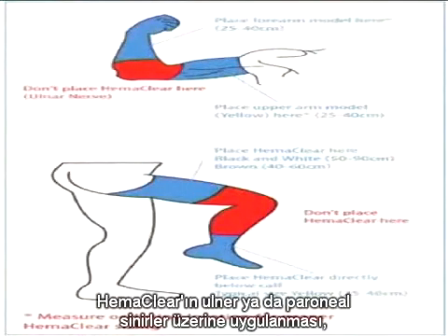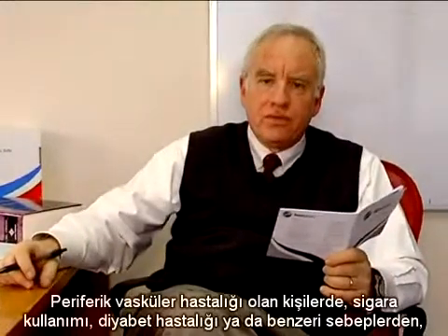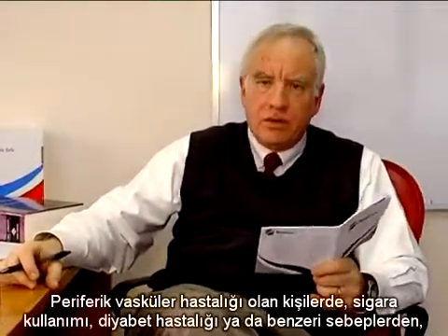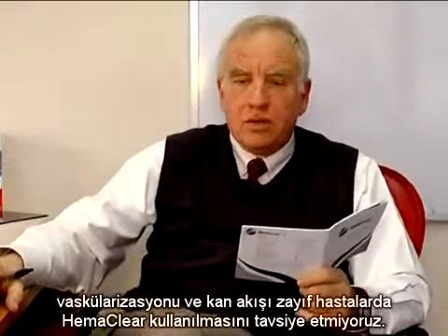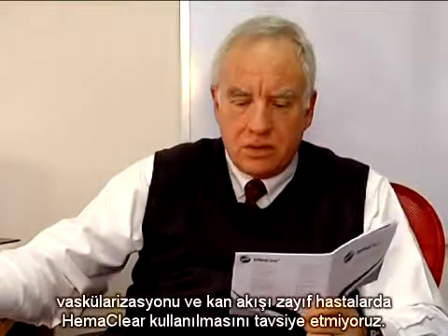We do not allow putting the HemaClear directly on the ulnar nerve or the peroneal nerve to avoid direct pressure on the nerves. Patients with peripheral vascular disease, poor vascularization and blood flow, we do not recommend using the HemaClear. Those are patients with diabetes, smoking, Buerger disease, etc.